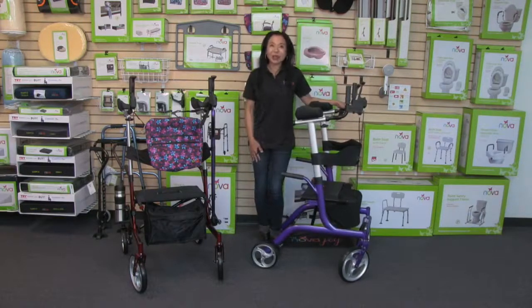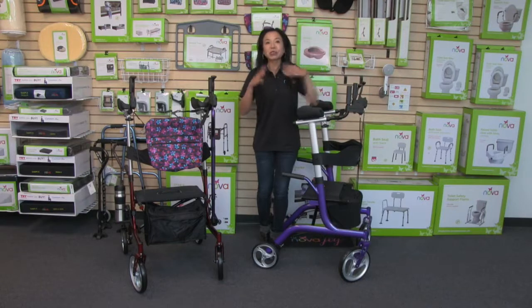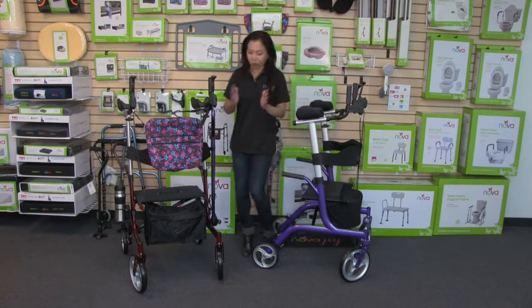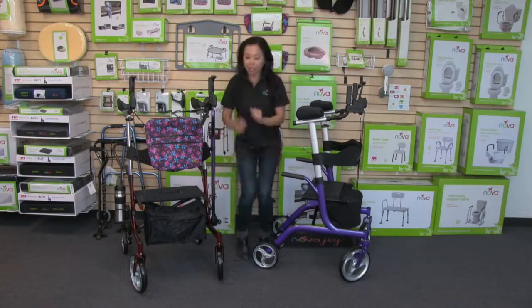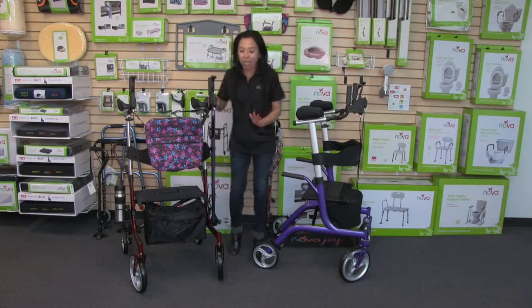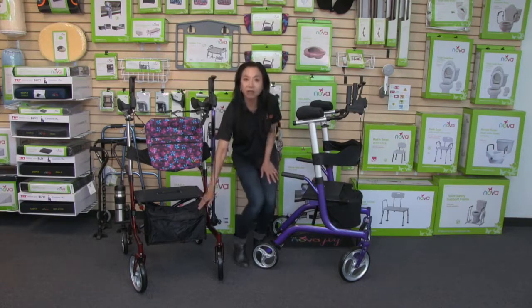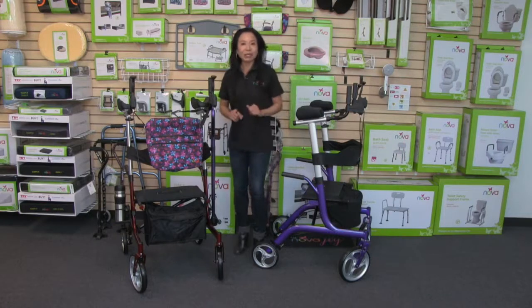Now let's talk about the great accessories that come with the Phoenix and those you can add as additional accessories. The Phoenix comes with two accessories: a cane holder, which is stored in the bag — you just take it out, pop it in, and attach a cane so you can have a cane by your side. It also has a very convenient front pouch with a zipper top to keep your private things personal.